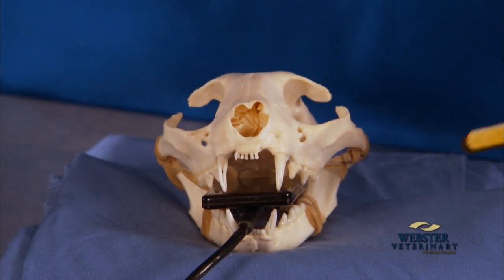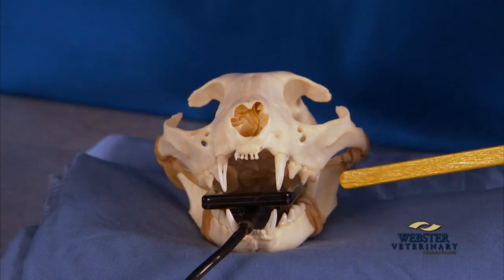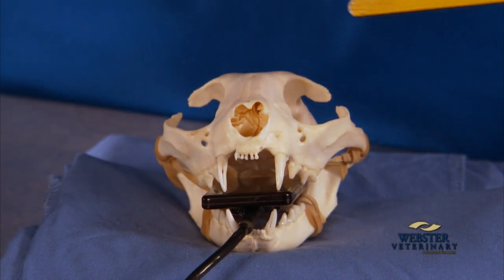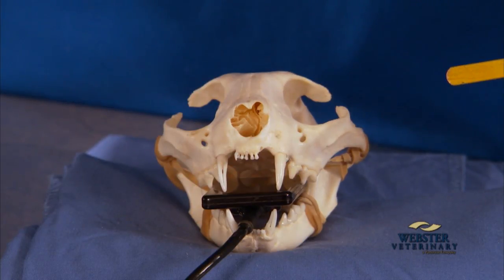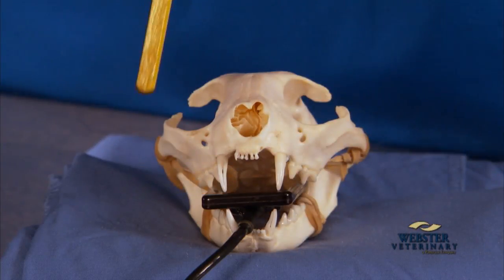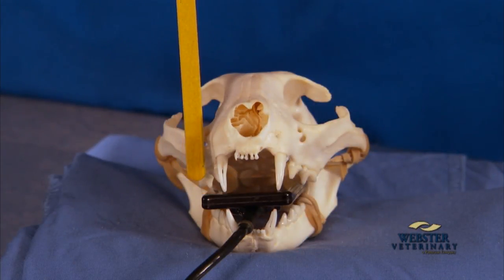Imaging of the feline maxillary premolars and molars is challenging due to the large zygomatic arches that are typically superimposed over the roots of these teeth. The sensor is placed into the oral cavity in this plane. The plane of the teeth is this plane.